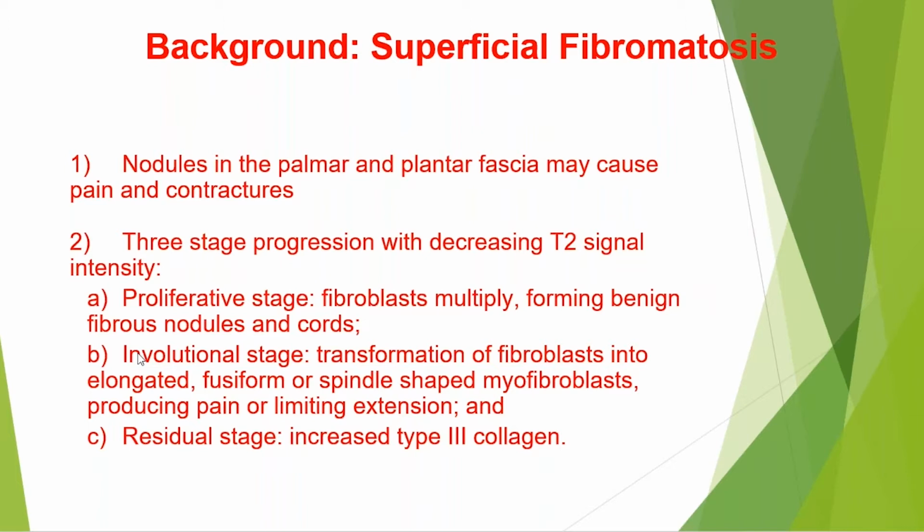It's at this initial proliferative stage where we felt our MR imaging was particularly sensitive in identifying the activity that could be amenable to definitive radiation therapy.